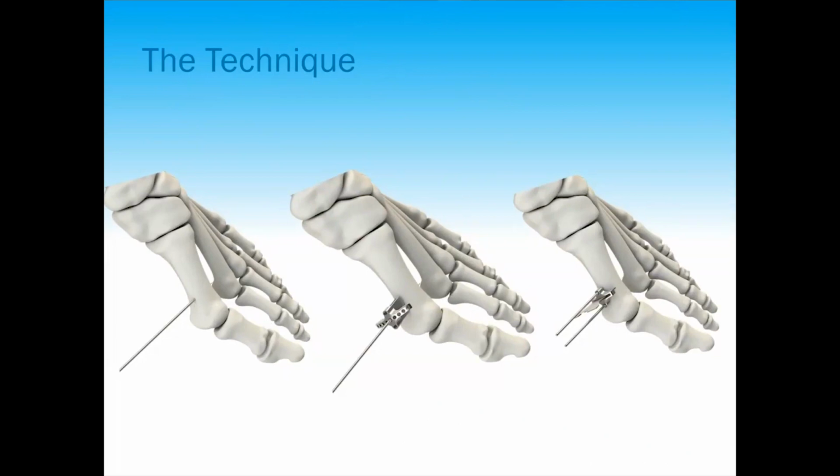So this first guide allows you to do multiple drill holes. You can see all the drill holes here. So you could create multiple drill holes at the neck level and then do your osteotomy with an osteotome. With this second guide you see on the right-hand side of the screen, you can either insert an osteotome or a saw through that guide.